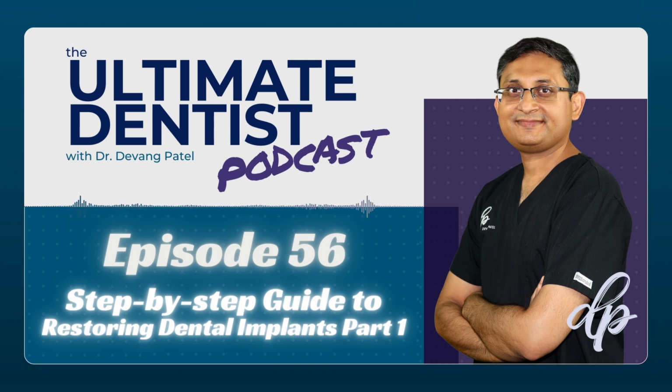Obviously, if you're doing full arch dentistry, then that's completely different. You can get away with 4 to 6 implants in 1 arch and restore the full arch. However, if you're doing full arch, generally it's 8 implants on the top and 6 implants on the lower arch. But again, you can get away with 4 implants on either arch. But that's different. So as I said, your surgeon might be able to make that decision. But my plan is generally I do not do a cantilever unless there is not enough space for me to place 2 implants. Number 10 is how you're going to provisionalize it.